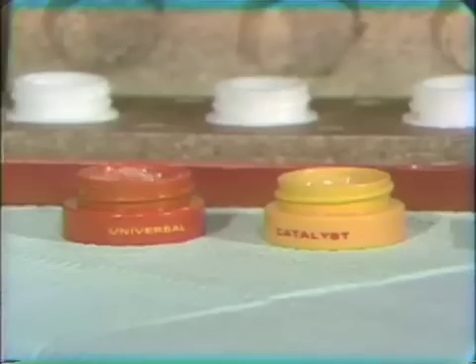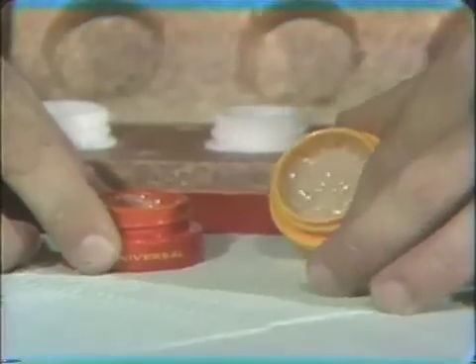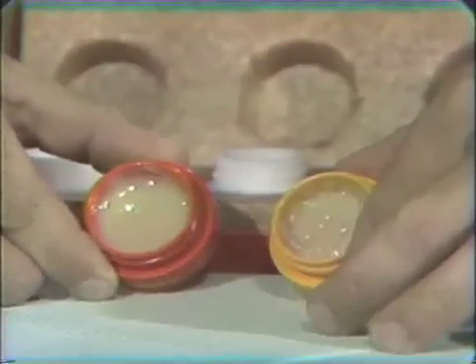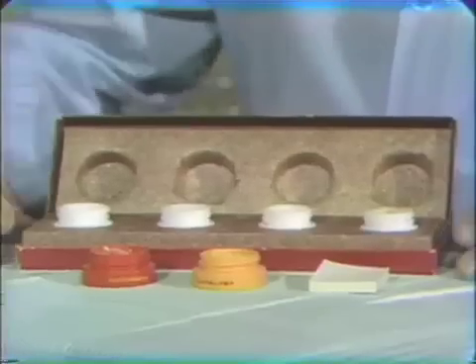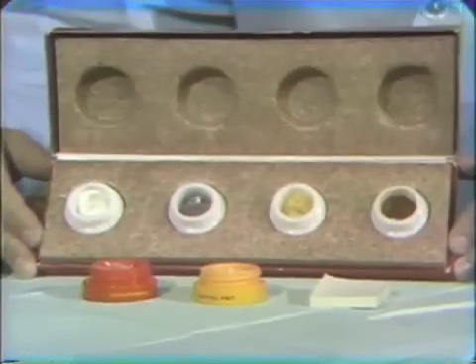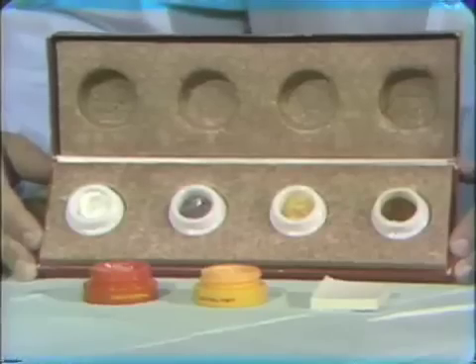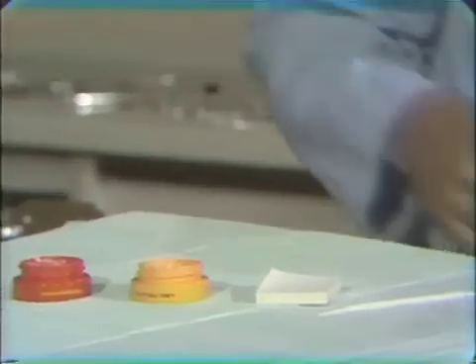We're using a two-paste system here in which we will use equal amounts of the catalyst and the universal paste. This two-paste system happens to have tints. Now, there are many times when you do need tints, and we will have them out in the dispensing area for you. The one thing to remember about using tints is that you have to use a tiny amount, and it would be well to mix a little bit and place a tint so that you know what you are doing.